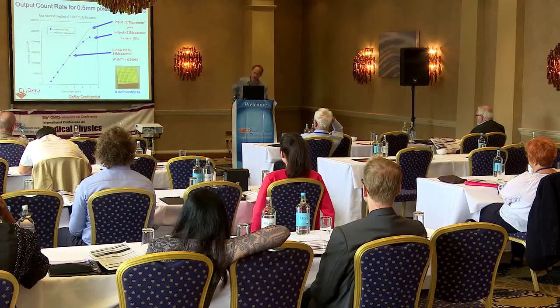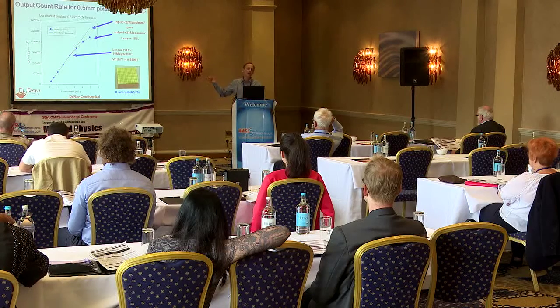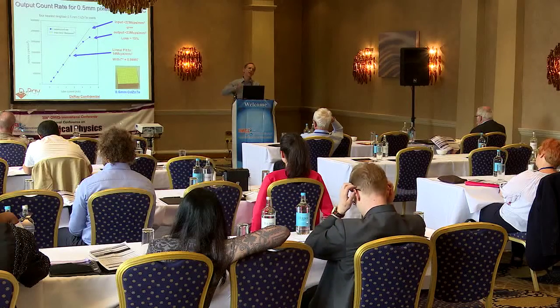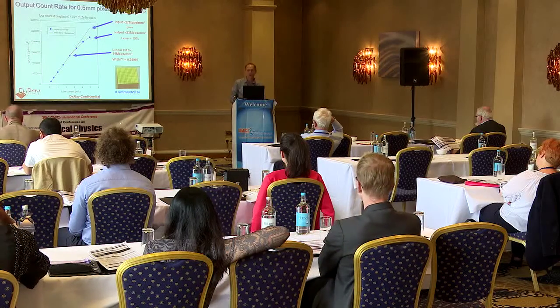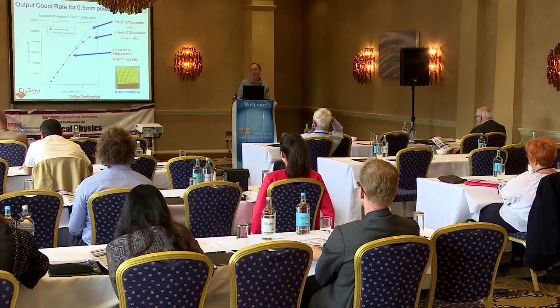into electrical charge. And so with this system sped up as fast as possible, we achieved an output count rate of 23 million counts per second, which had only a loss of 15% and a linear response up to 14 million counts per second per square millimeter. So we're getting close to achieving a linear response over the entire counting range, which is required for cardiac CT, and this was done in 0.5 millimeter pitch cadmium zinc telluride.